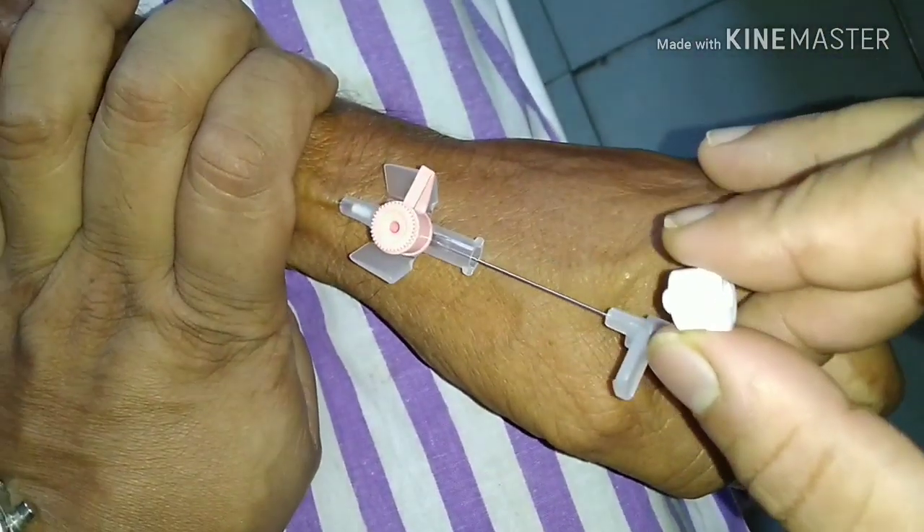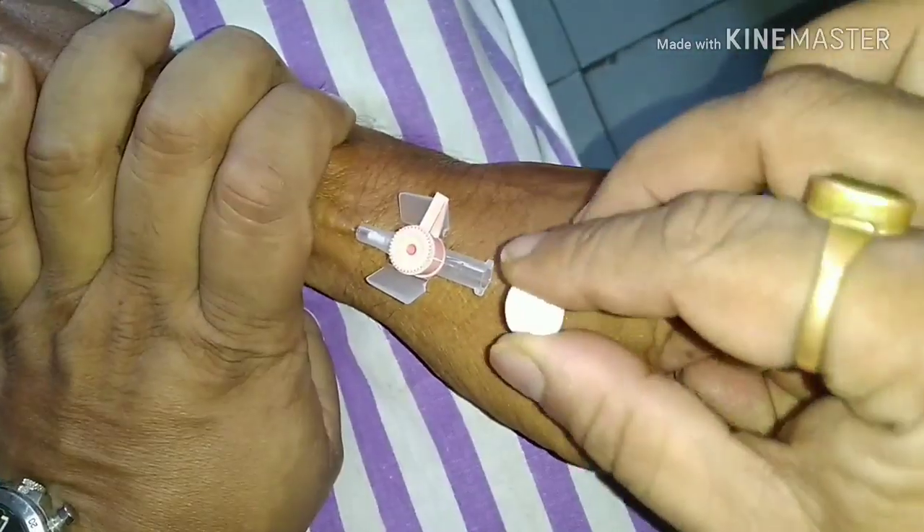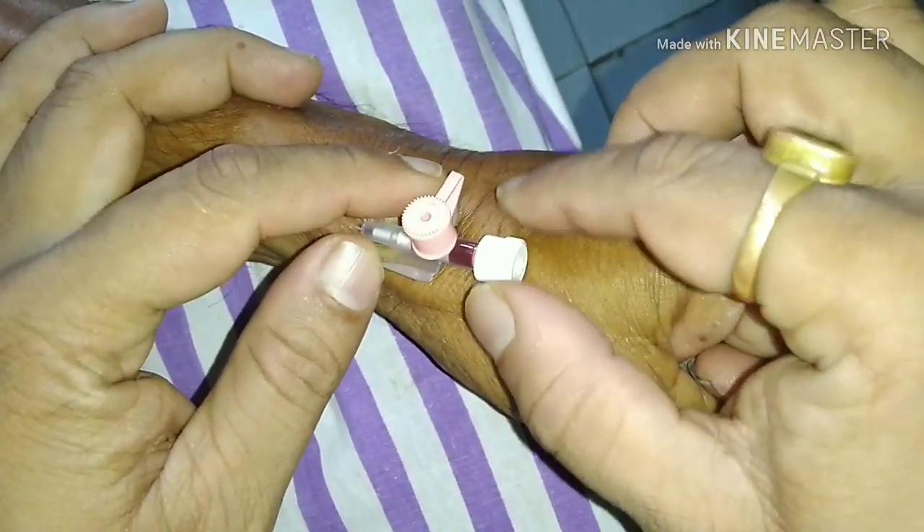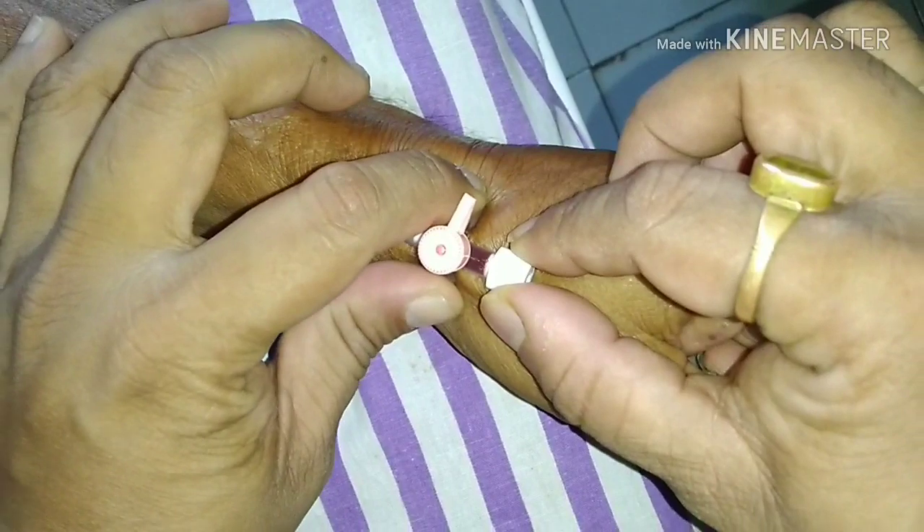Remove the caps, lock the venflon, and fix it properly.